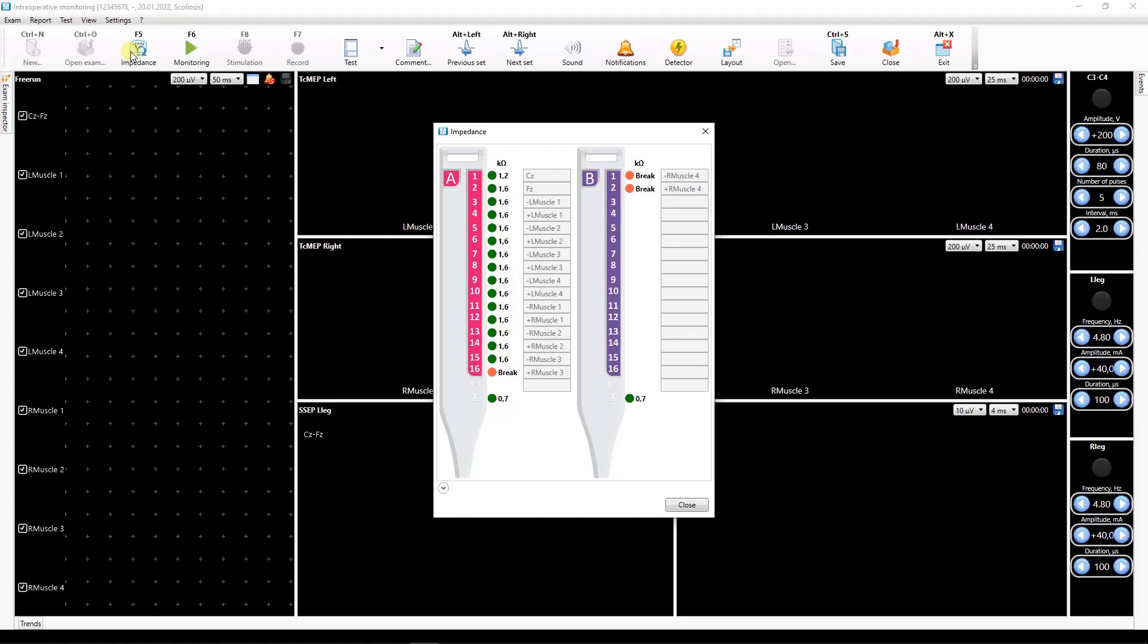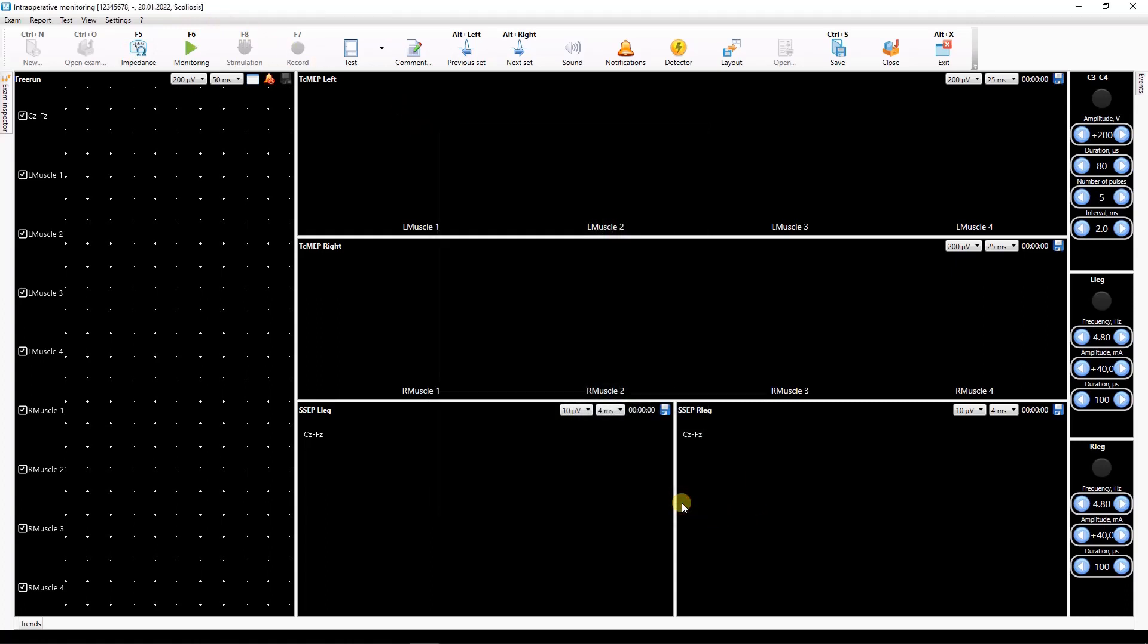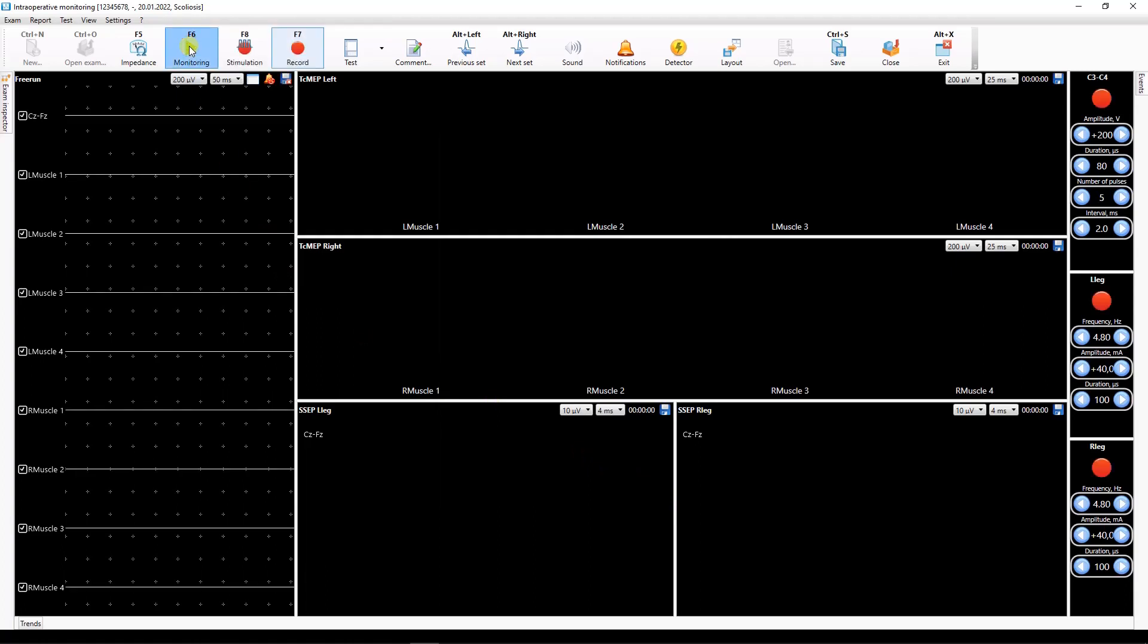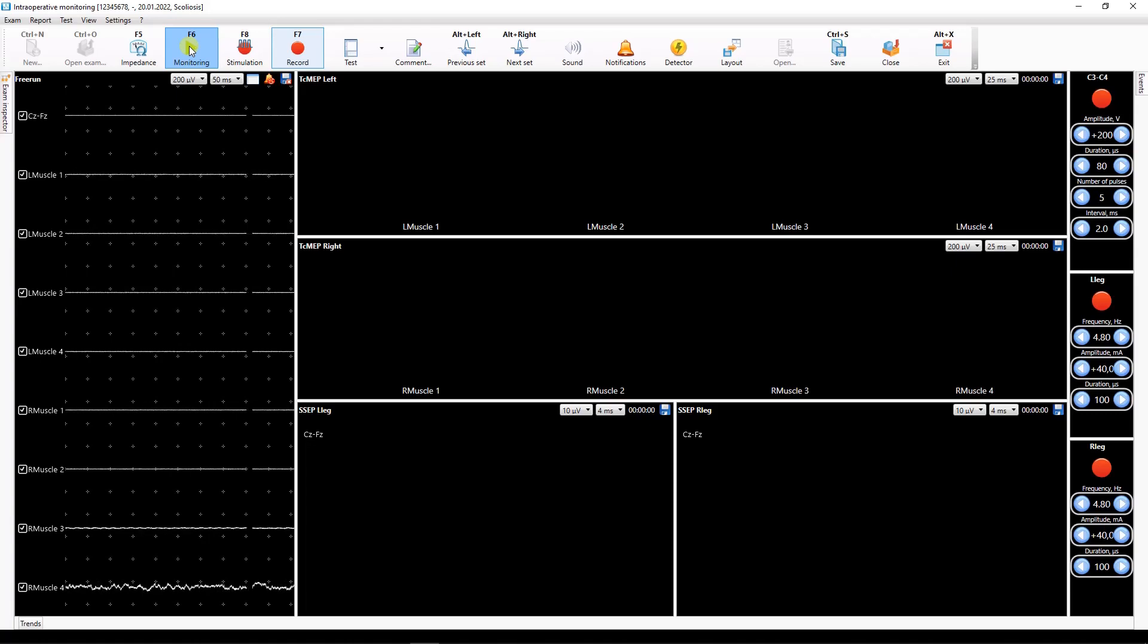If all electrodes are placed correctly you can start the monitoring. Press the monitoring button on the toolbar. The recorded traces will appear in the free run window.